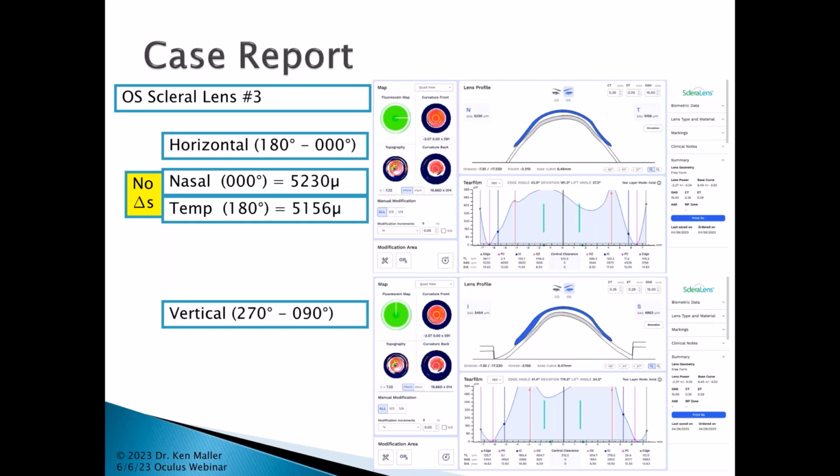But of course, the patient is going to be very uncomfortable if you've got their eyes pried open and they already have a compromised tear film. For any of those people, or sometimes, again, on some of these very, very difficult to get scans on patients, because of all the scarring and things like that, sometimes I will put some proparacaine in their eye just so they're not so physically bothered by having to sit there and keep their eyes open while I'm trying to get a good scan.